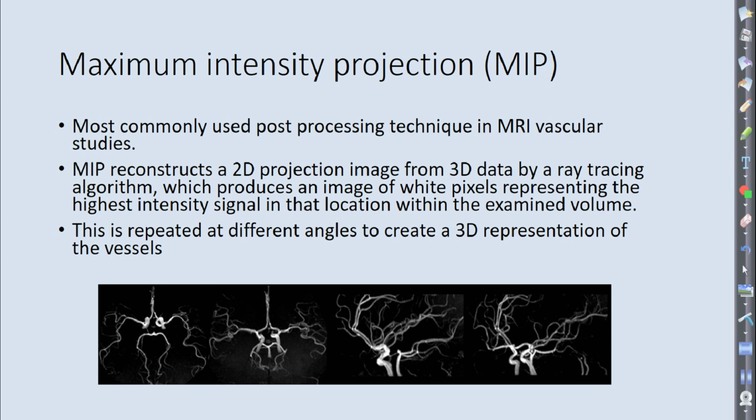So I was with Tyler yesterday, and she had filled up all her brain categories, but on every brain you do a reformat MPR. So now she can put those brains under her post-processing tab on ART. So make sure you're utilizing all those brain scans to the best. Put it in a category that you can count it.